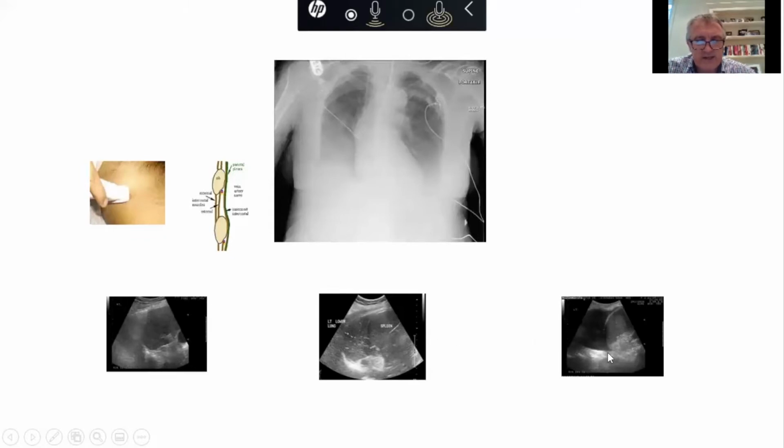So when the lung is abnormal, it's replaced by fluid, or the pleura has fluid within it, and this is the image that we get. Here we have the visceral organ, it's probably spleen again, and then we have this echo-poor area, and this is what fluid looks like. It's highly transmissible. Again, there's no image because sound waves are transmitted through, as opposed to this area, which is soft tissue.